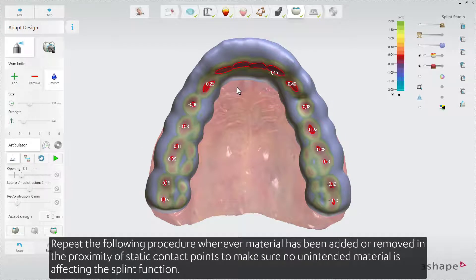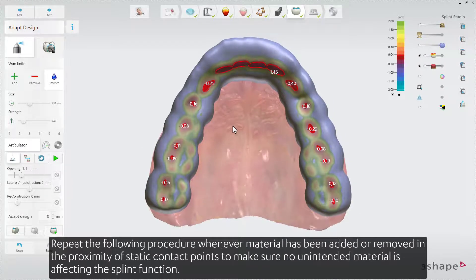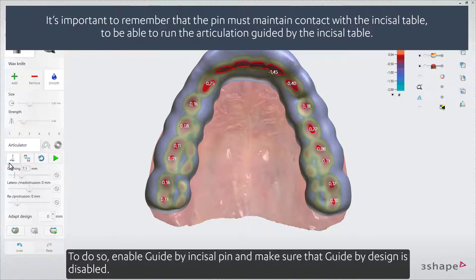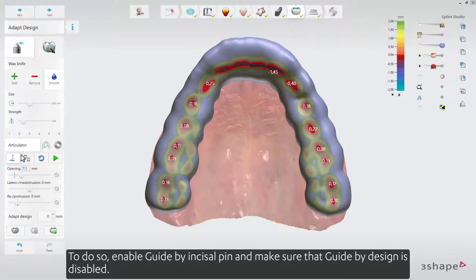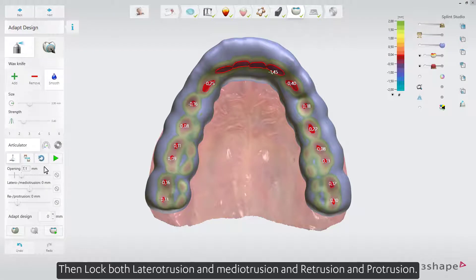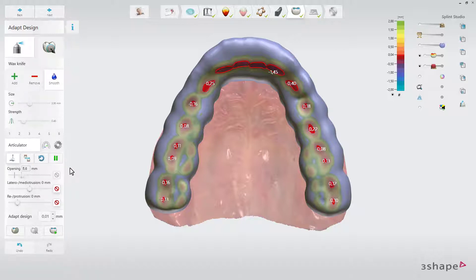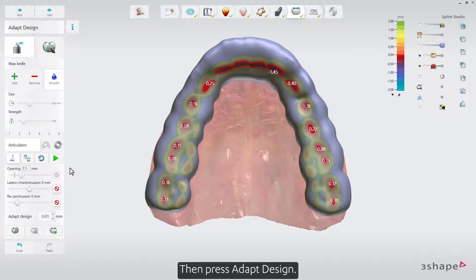Repeat the following procedure whenever material has been added or removed in the proximity of static contact points, to make sure no unintended material is affecting the splint function. To do so, enable Guide by Incisal Pin and make sure that Guide by Design is disabled. Then lock both lateraltrusion and meditrusion, and retrusion and protrusion. Now enter a value of 0.01 mm in the Adapt Design field, and run Articulation.